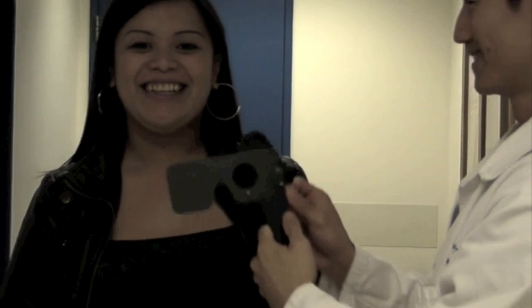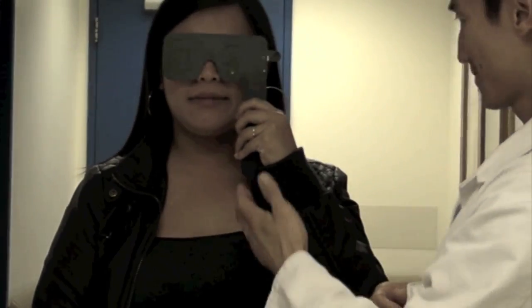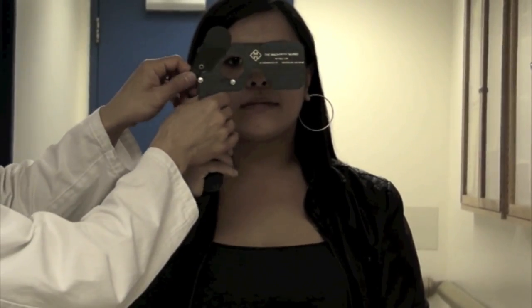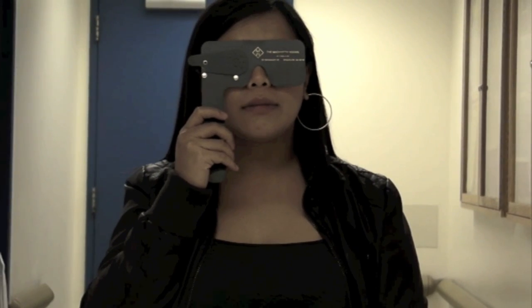If a patient has decreased visual acuity, the pinhole mask may be used to estimate the eye's best potential vision if there is a refractive error. If a patient's visual acuity improves with the pinhole mask, that improvement is attributed to refractive error. Before patient use, you should wipe the pinhole mask with an alcohol or sterilizing wipe.